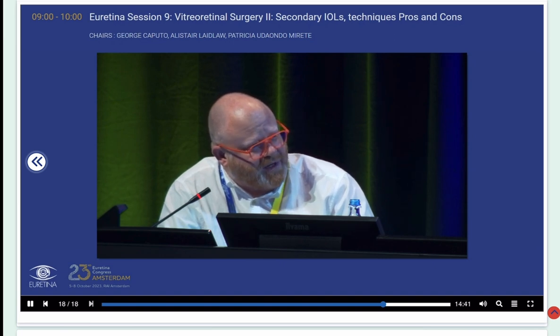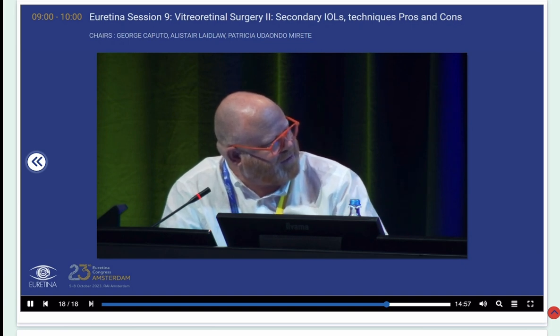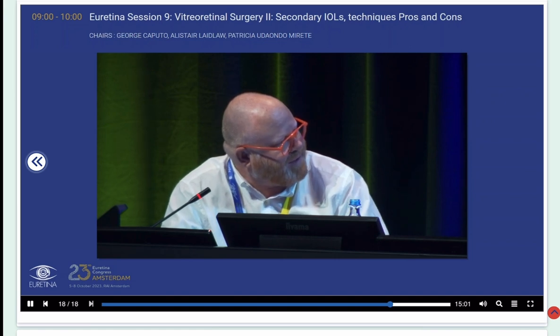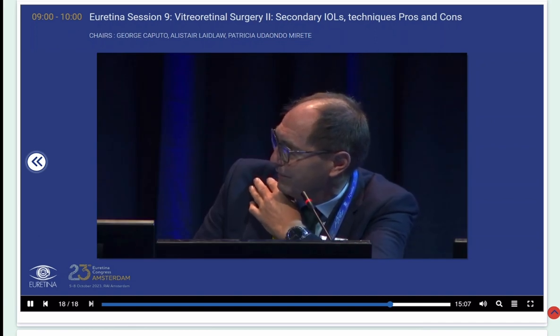One other thing, since I've been placing them on the posterior side, I have stopped using the iridectomy. And I've not had any problems with those ever. Yeah, the only time when I saw any pupillary block was when one of my colleagues actually put it on the front again and forgot to make the iridectomy, and the next day, yeah, the lens was in the endothelium, of course.